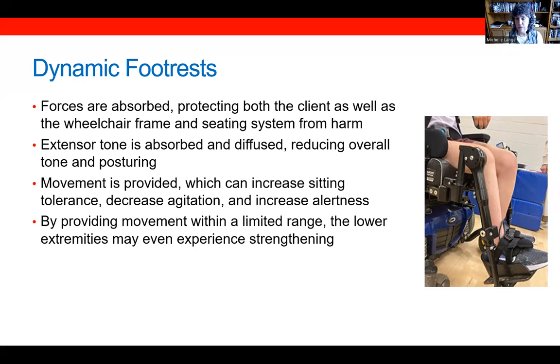And movement is provided. And by providing movement, the client may be able to tolerate sitting in the seating system for a longer period of time, perhaps show a decrease in agitation and even an increase in alertness. And by providing movement within a limited range against a light amount of resistance, we might even see an increase in lower extremity strength.